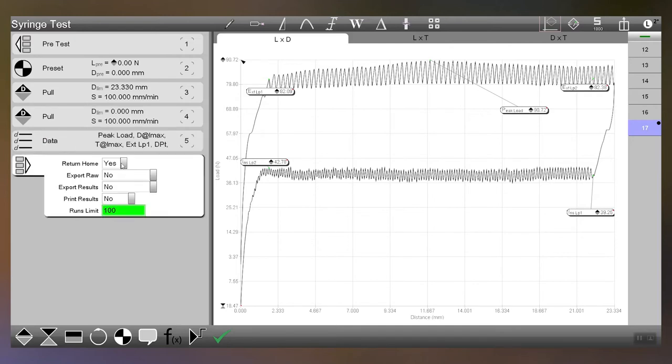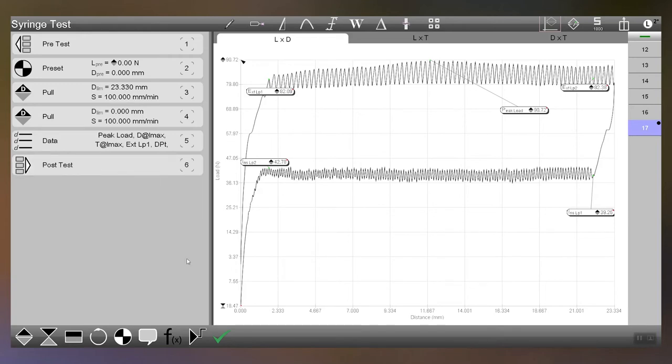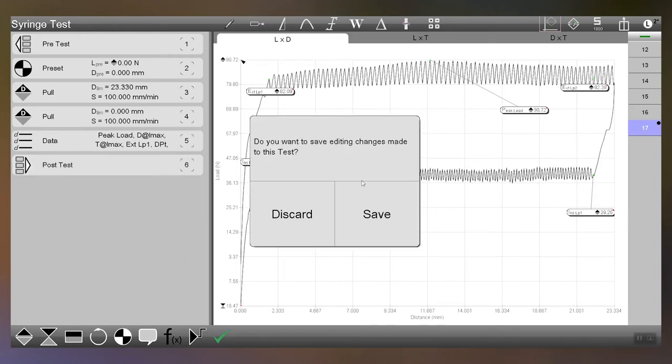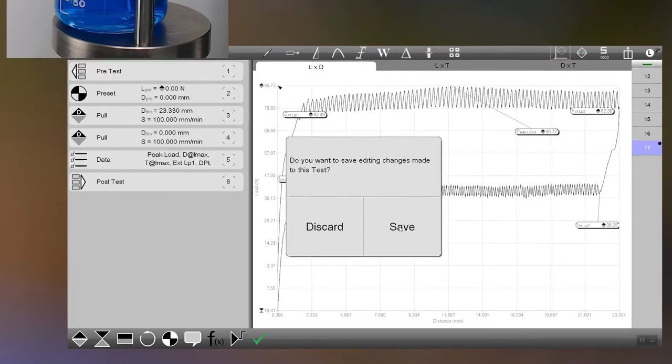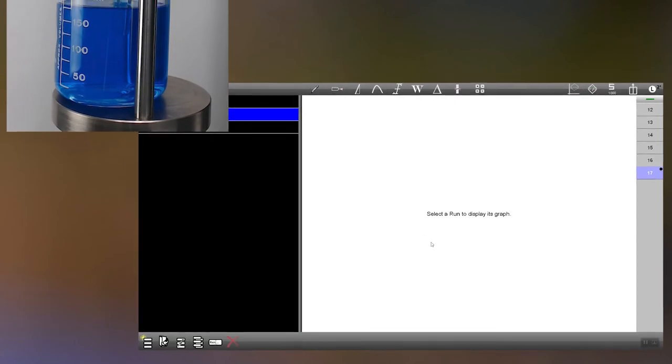In post-test all we did was tell it to return home after that so it went back to its home position. That's the entire test so let's move into actually running the test.